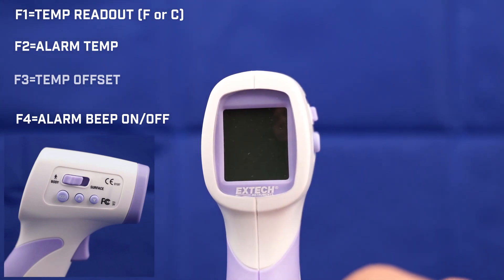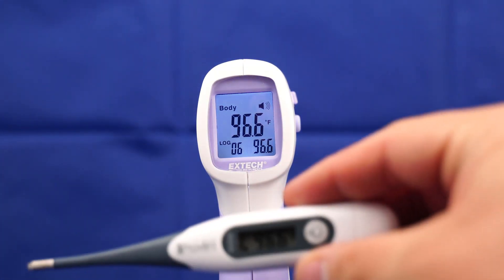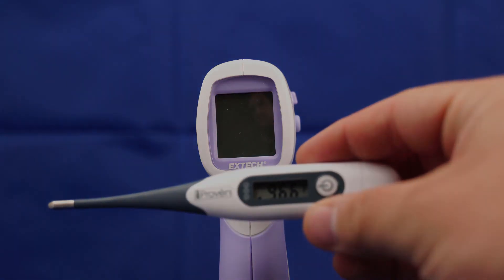After that, let it go for a second and it's ready to use. After we have set our offset, we want to take another reading with the IR200 and compare it to our thermometer. In this case, they both match: 96.6 and 96.6.